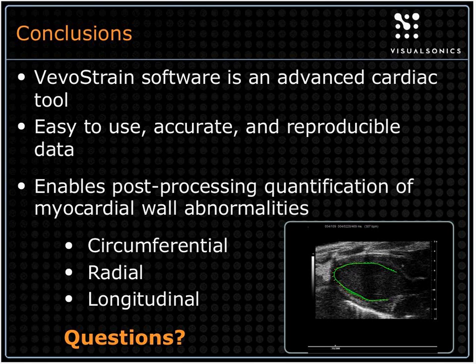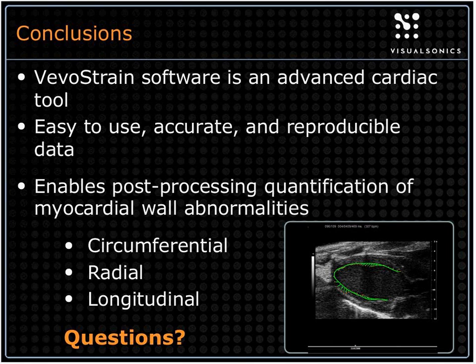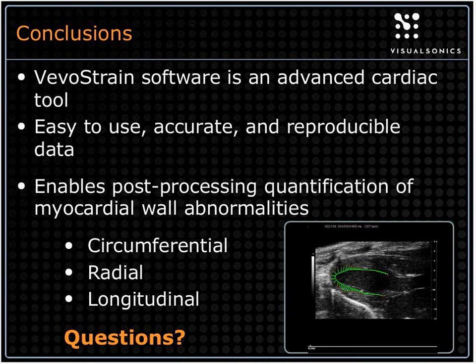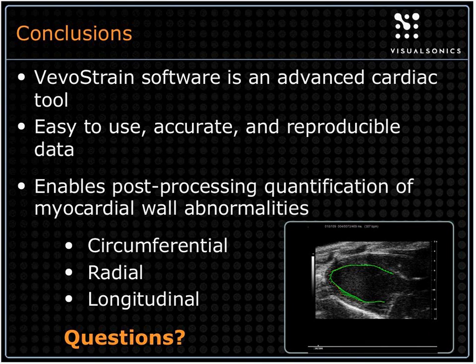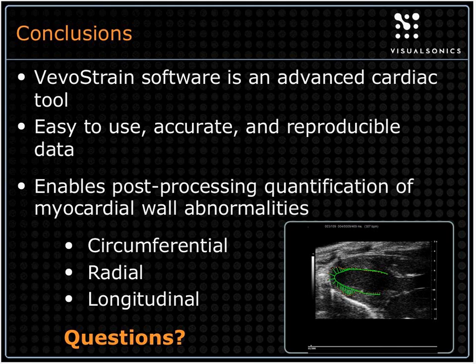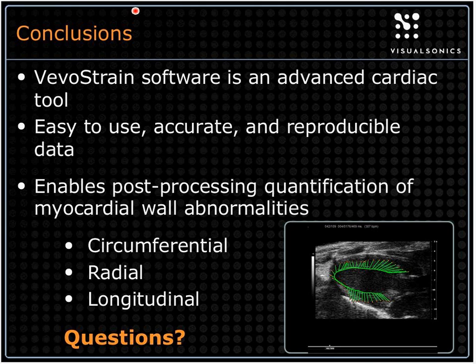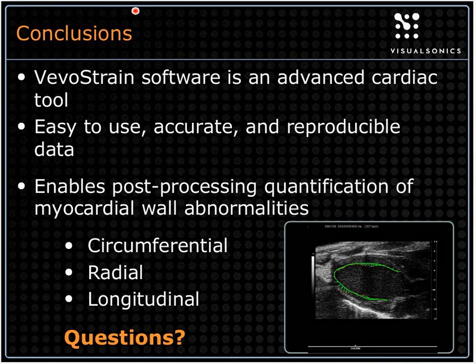Okay, thanks, Stephanie. From many of the listeners out in the field, are there any questions at this point before we move on to the more demonstration portion of the webinar? I don't see any questions right now, so why don't we let Stephanie continue. If you think of more questions while we continue, we'll have another period at the end where we can certainly take some questions.